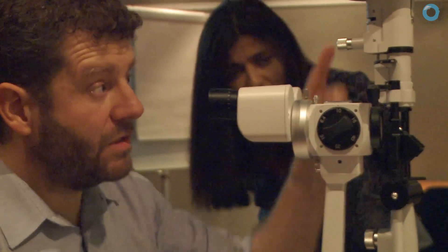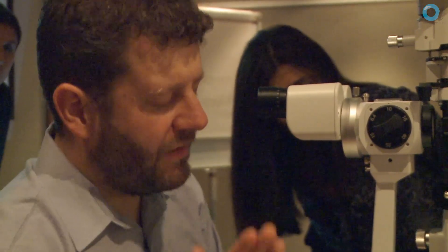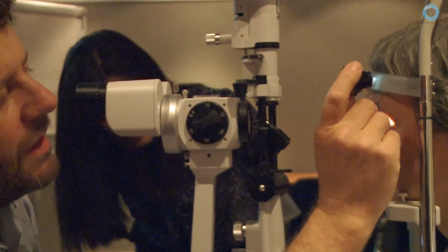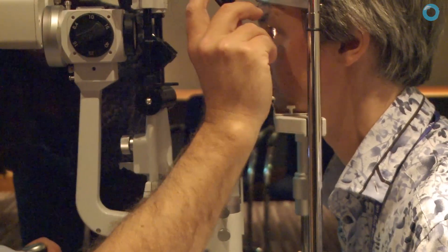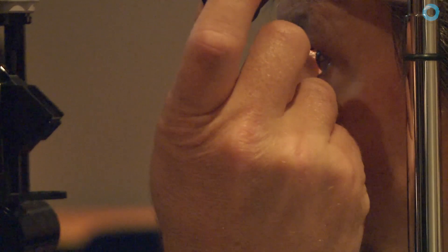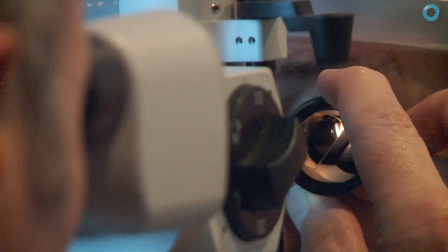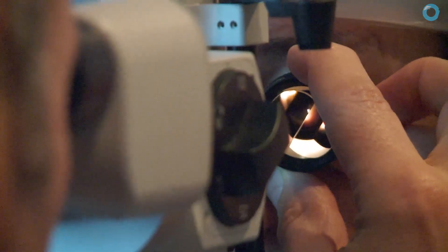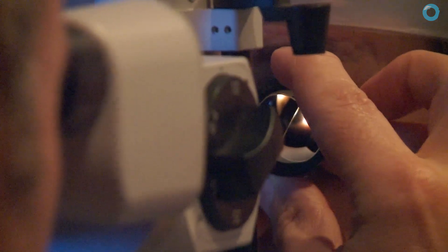The lamp housing for the top and bottom angles is angulated off to one side with a vertical beam, and if you don't do that you will not be looking at the light from the side — you'll be looking at it from straight on. There are different ways of inserting the lens. What I tend to do is use my ring finger to hold the lower lid, ask them to look up, angulate the lens towards the eye with the angulated beam, and then you're looking for the beam from the side on. What you see is basically brown iris and then white sclera above it, and sometimes you see some brown lines along that.